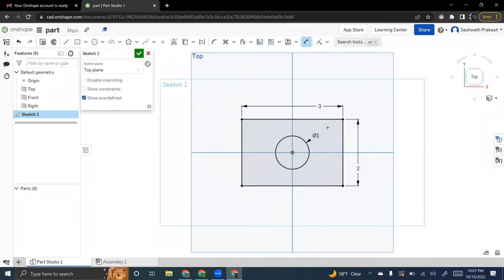So what we're gonna do is we're gonna actually go to sketch one. So we double clicked on it so we can see this box. We're gonna left click on that. So I want you to go to center point rectangle. Good. I want you to drag your cursor to the middle until that dot is orange. Interesting. Let's actually delete this sketch then.